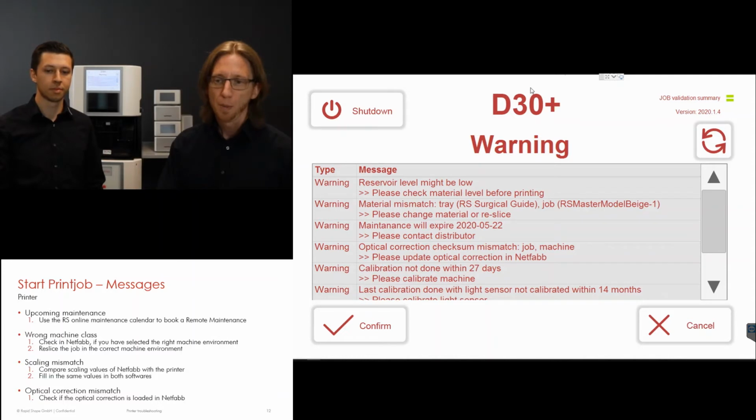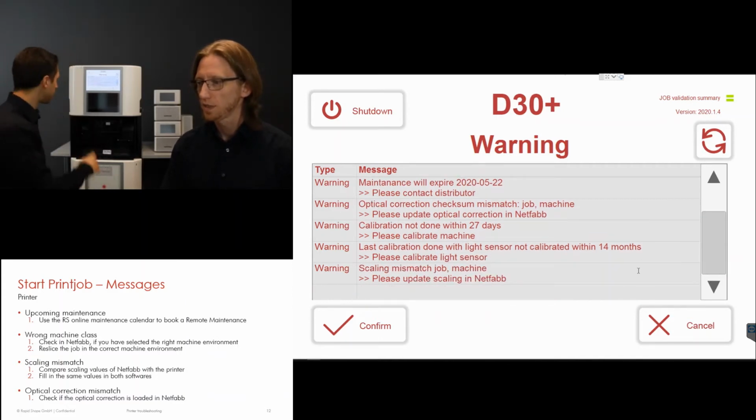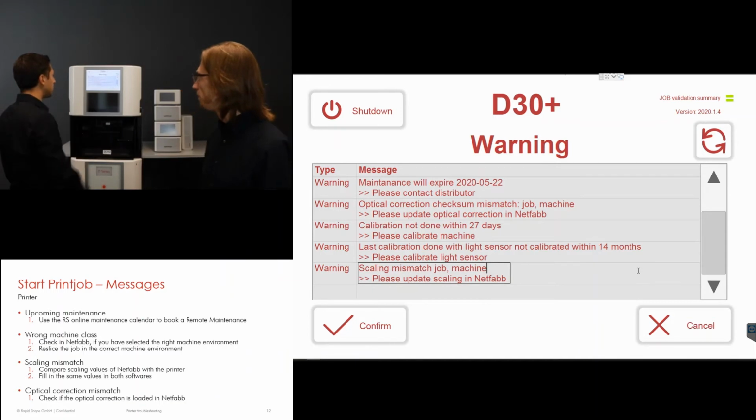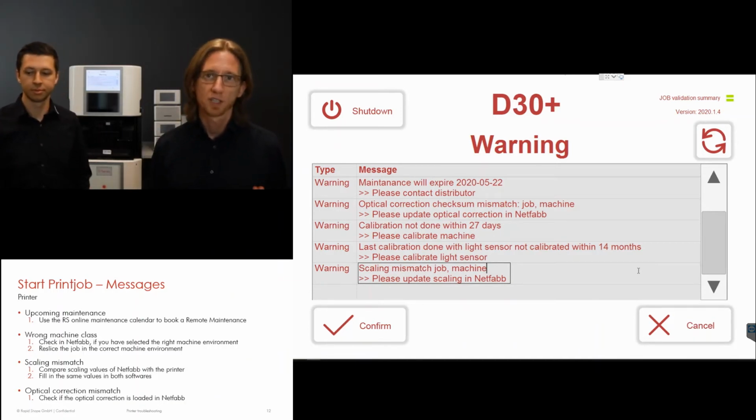All right, then the next thing would be scaling mismatch. Scaling mismatch, I think we can see it right here on the bottom. Thanks for highlighting it. Scaling mismatch, what does that mean?